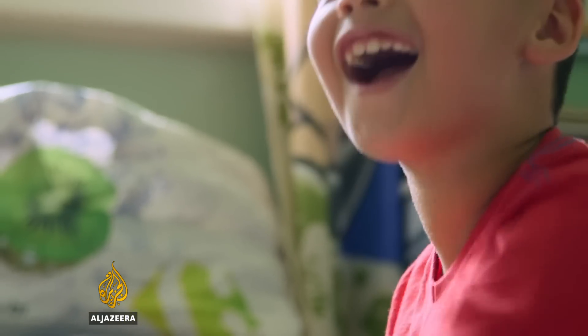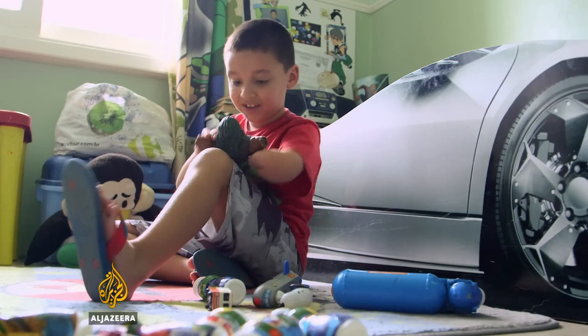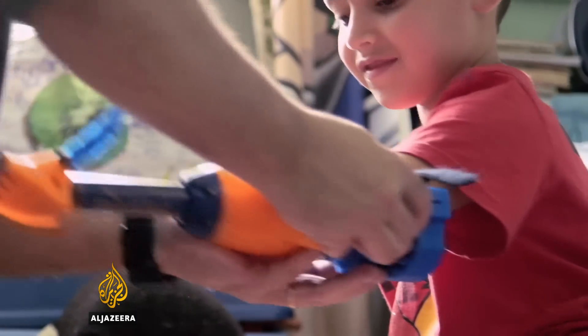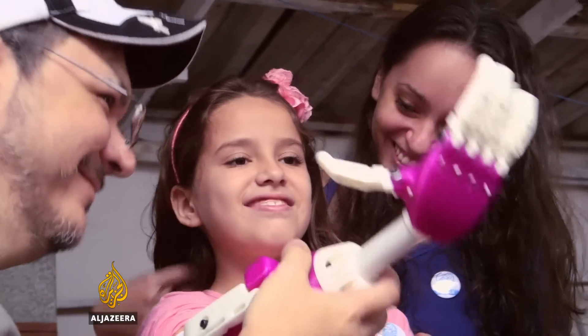Recent developments in bionic prosthetics offer many without limbs a life-changing opportunity. And yet for most, especially those in the developing world, these advanced prosthetics are financially out of reach, leaving them with little options or nothing at all. I'm Dr. Javed Abdelmune in Brazil to see how new open-source designs and advances in 3D printing are bringing affordable prosthetics to children all around the world.